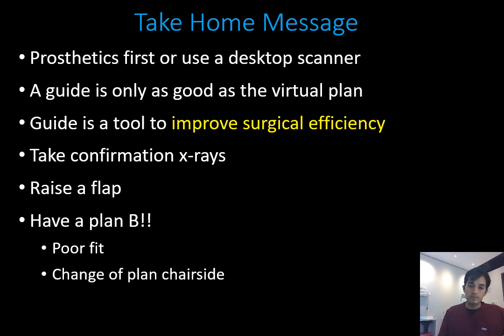Raise a flap when necessary. Just because you have a guide doesn't mean you have to go flapless. By all means, do a second stage procedure later if you want to play around with the soft tissue profile. Don't limit yourself to only going flapless. And as I said earlier, have a plan B just in case your guide doesn't fit. It's our own fault that it doesn't fit, but you've got to be able to finish the case off anyway.